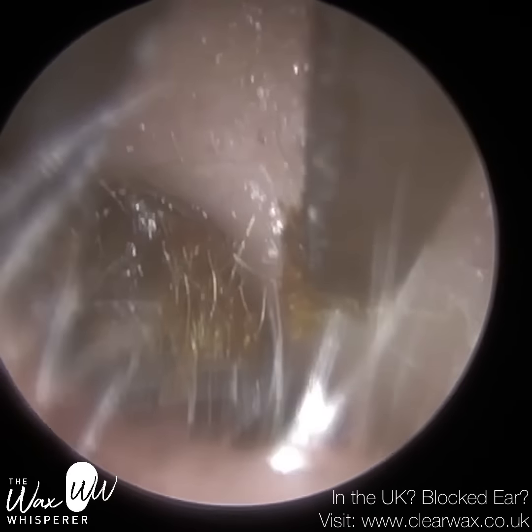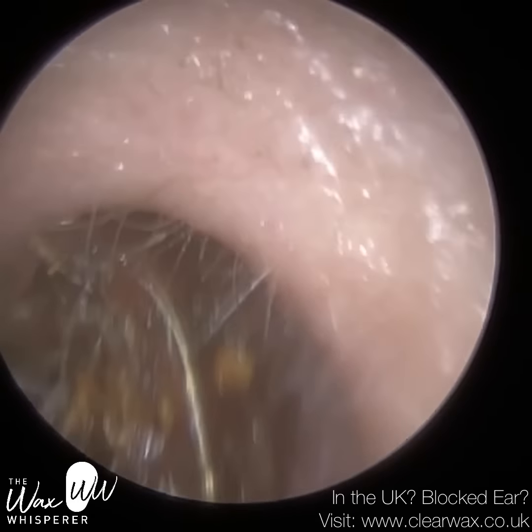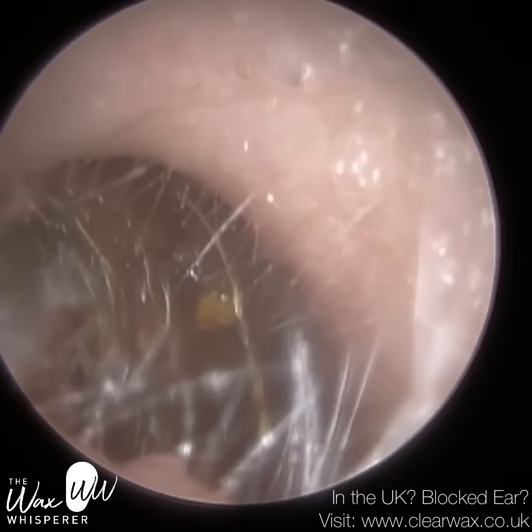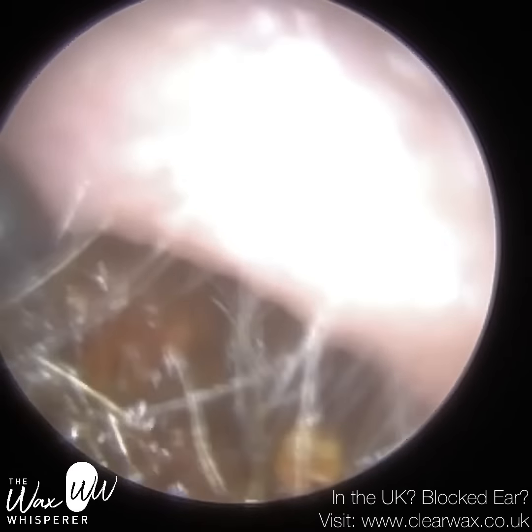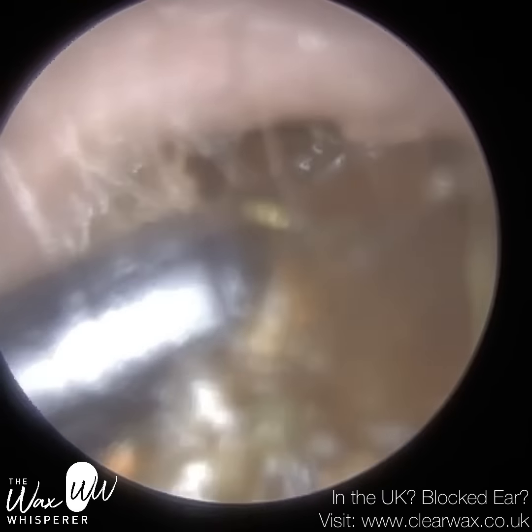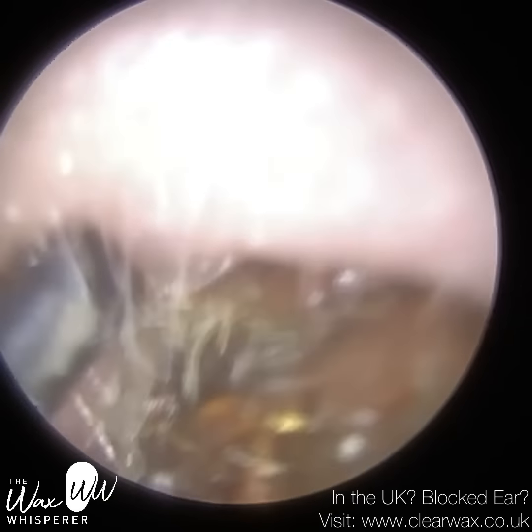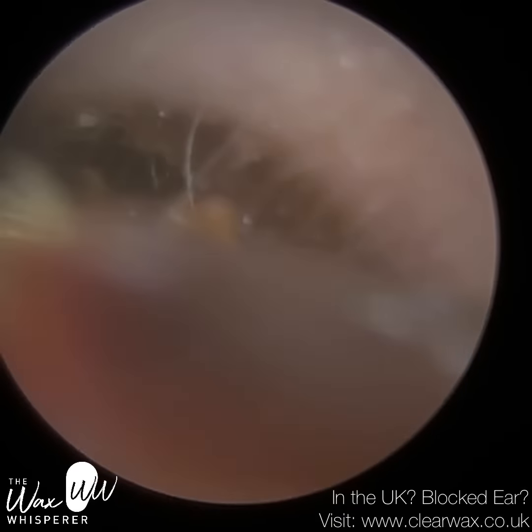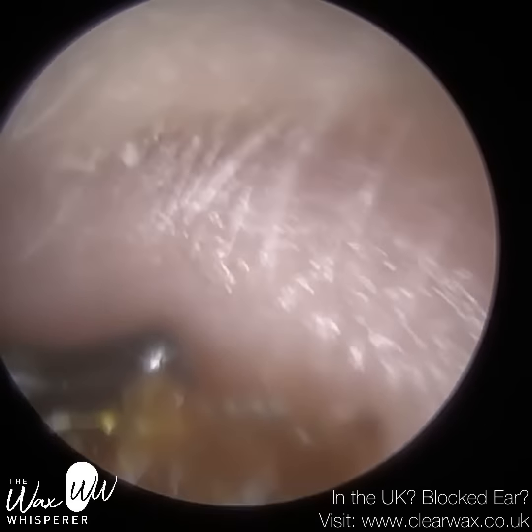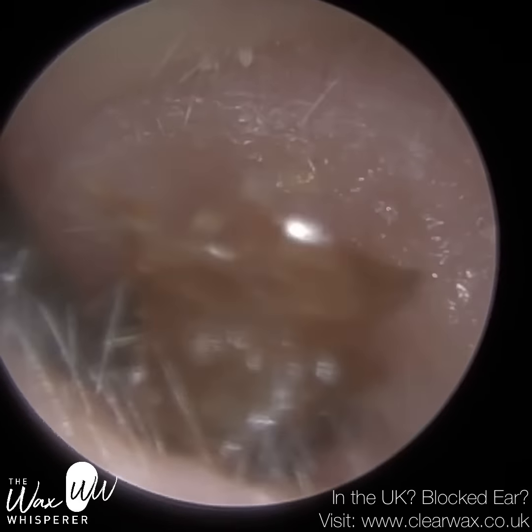And okay, the forceps didn't bring it out of the ear, but it's right near the entrance now. So I'm going to use a hook. I'm going to go to the top of the ear canal, and I'm just going to slowly bring this forwards. You can see I'm just flicking it forwards almost. Then I'm going to go back in, flick it again. Now I just want to go in and behind the plug. It was extremely hard as well, this plug.